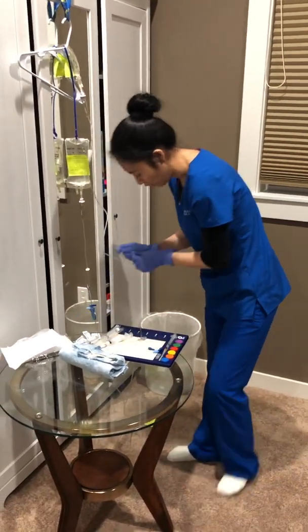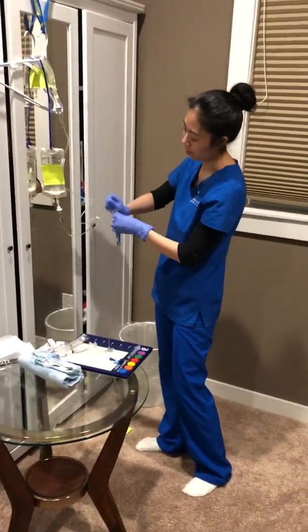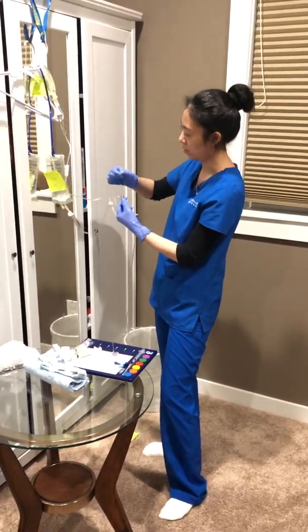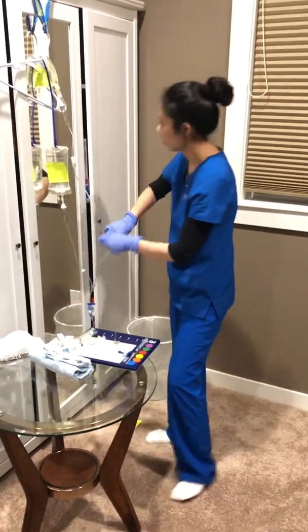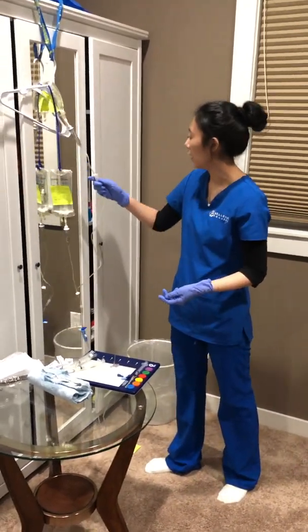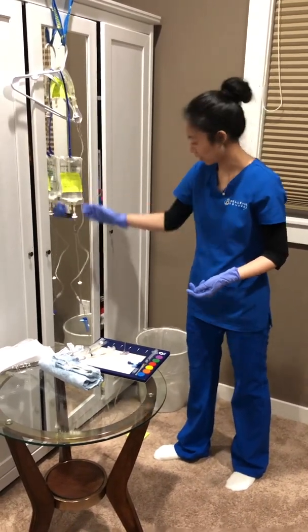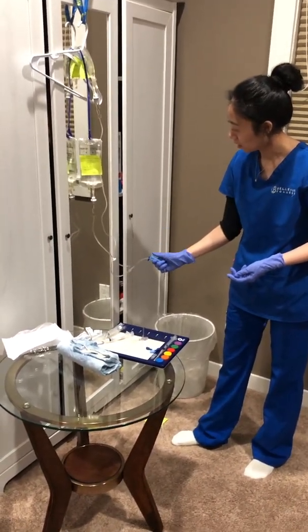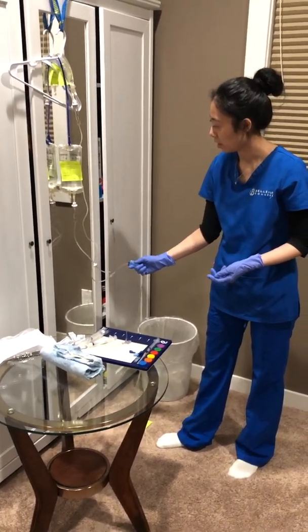And then I use the alcohol wipe. Wipe for 30 seconds. Wait for it to dry. Open the clamp. This one, sterile to sterile. So no air bubble all the way down. And I unclamp it. Check the rate. Good. And I unclamp this one, the primary one. Make sure both of them are at the right rate. Good.